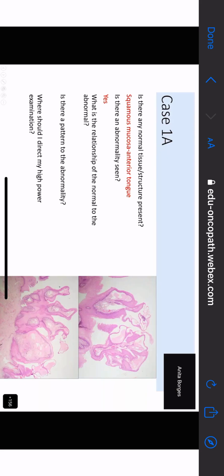Ma'am, some of these cystic spaces are lying intraepidermally. Some of the cystic spaces? Only some or all? Ma'am, some are lying intraepidermally and many of them are lying in the stroma, that is in the subepithelium. Some of them are lying intraepidermally. You can actually see them in the epidermis. Can you point out one over here that is lying in the epidermis? Yes, ma'am.